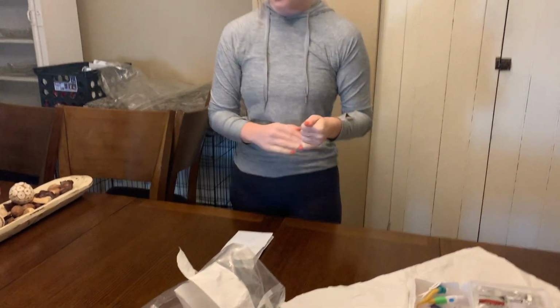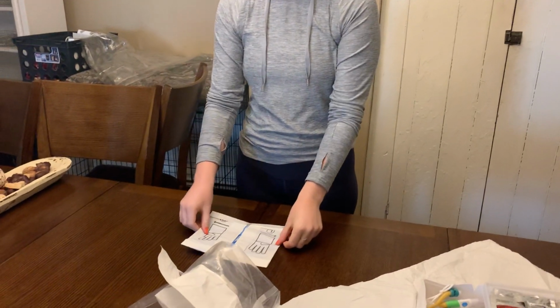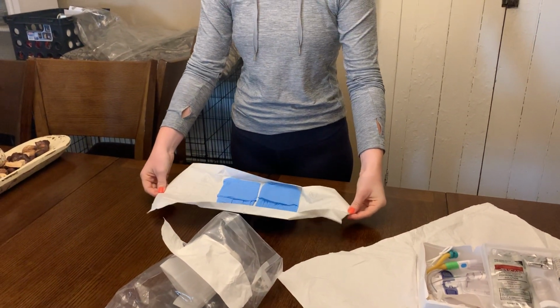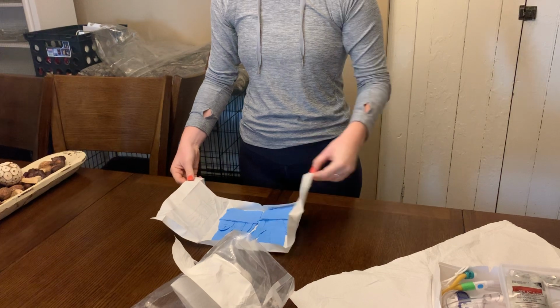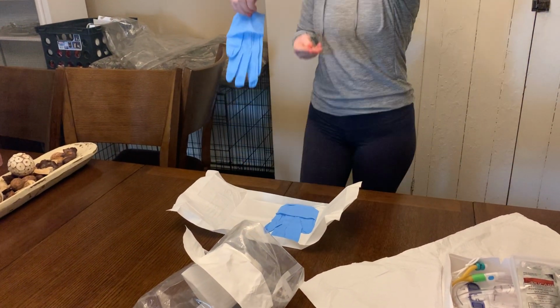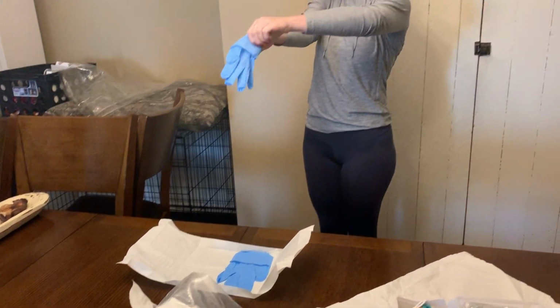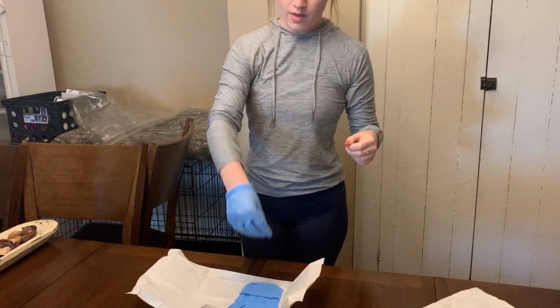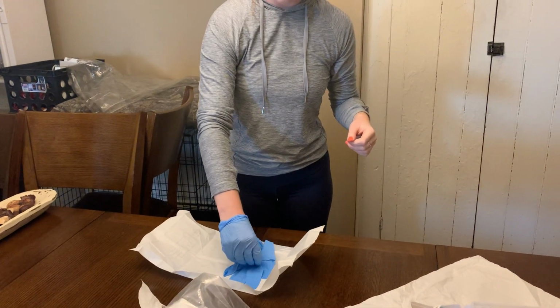and then I'll be putting on my sterile gloves. I'm going to start by opening them, touching just that outer 1-inch border. Now I'll glove my dominant hand first. I'm going to grab the cuff and step back. Okay. And then I'm going to grab the cuff of the other glove.